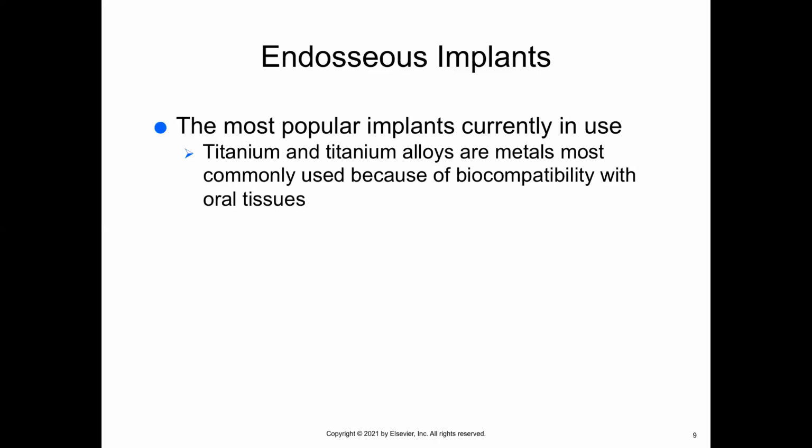There are 3 basic components to dental implant crowns and bridges. The implant fixture, which is the portion of the implant that is placed in the bone and remains there to support the crown. The implant abutment, which is the attachment of the implant fixture that protrudes through the gingiva and acts like a tooth preparation on which the crown attaches or the prosthesis rests. This is usually attached to the fixture with a screw.